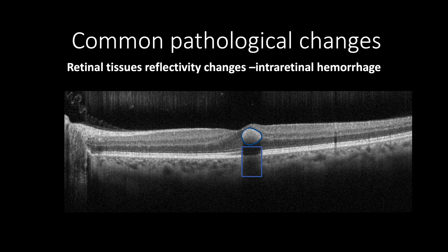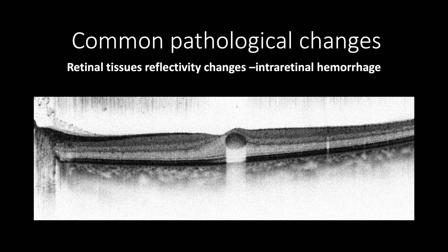In contrast, in negative black and white, the intraretinal hemorrhage will appear as a homogeneous black color with smooth regular borders casting white shadow hindering the underlying retinal tissue.